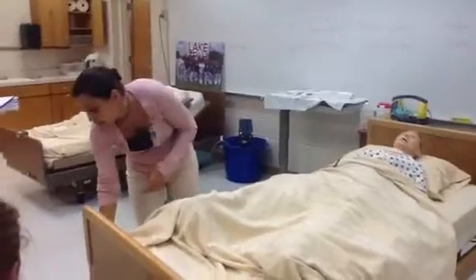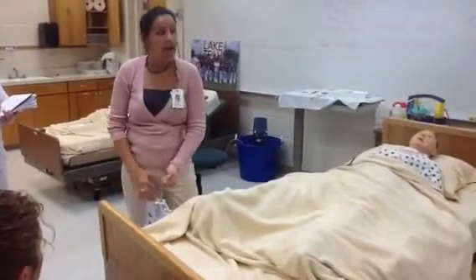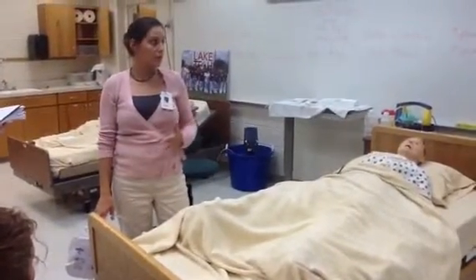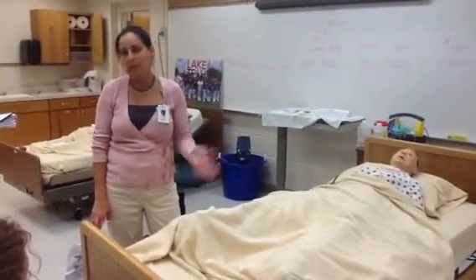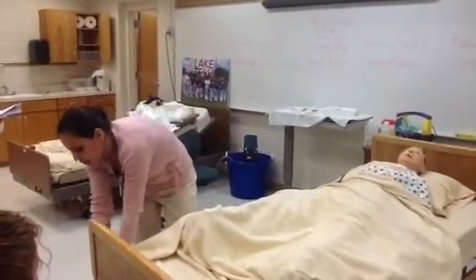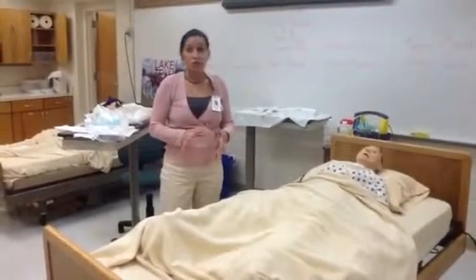And by clamping it off, I only mean that you have to hold it in your hand for 15 minutes and then let it continue to drain. And we do that between 800 and 900 mLs. So if we've got a lot in that bladder and a lot is coming out, then we just stand here and wait until it slows down or stops. And if we get to 800, then we clamp it, wait 15 minutes, and then let it continue to drain. All right. And like I said, you will understand more about that particular process when we get through the pathophysiology of catheters. Okay? Any questions?